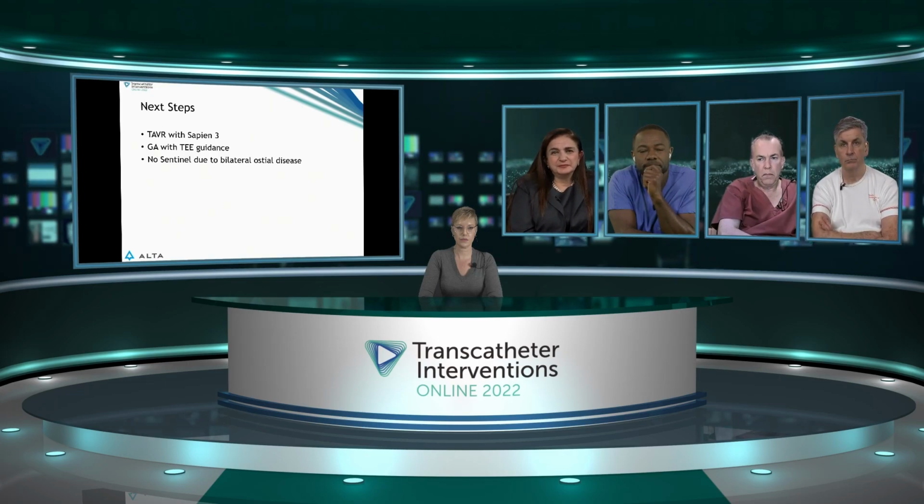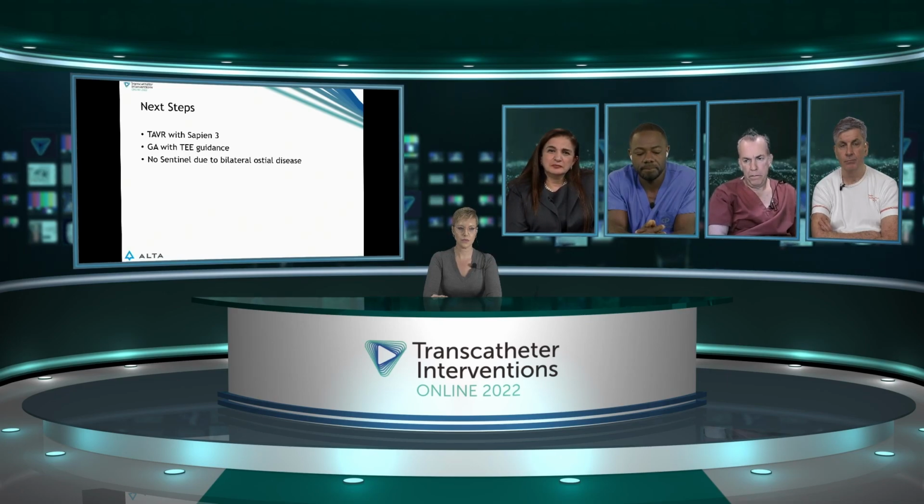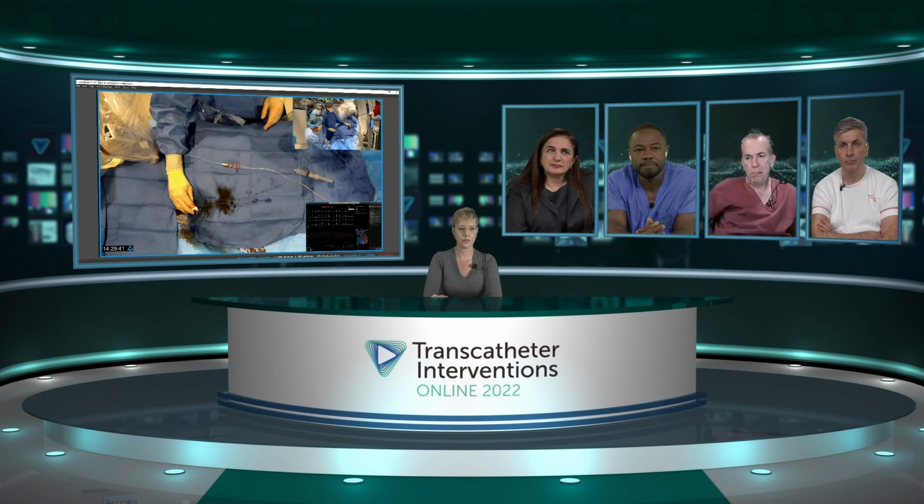The majority of our cases are awake, but in complex anatomies, borderline sizing, calcified raphe, bicuspid, we believe strongly that having complete imaging is important. We use embolic protection in more than 90% of our cases. This gentleman unfortunately had significant plaque at both ostia that we felt it was not safe to do embolic protection. If we can switch back to the other screen, we're going to have Becky go through the echo images. We'll end the PowerPoint, and then we'll tell you where we're at.